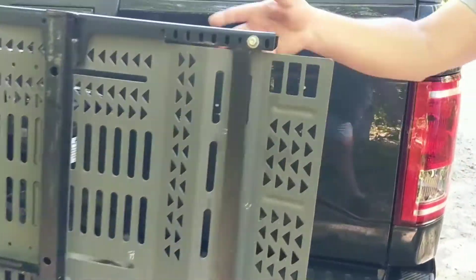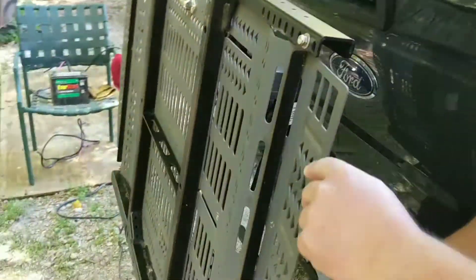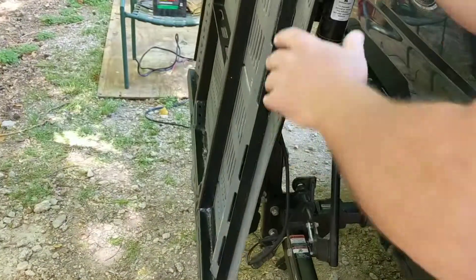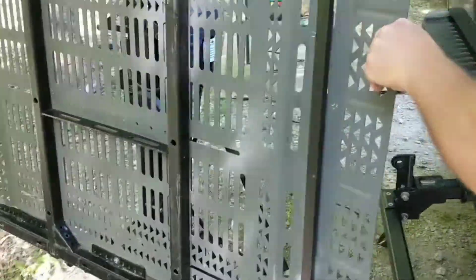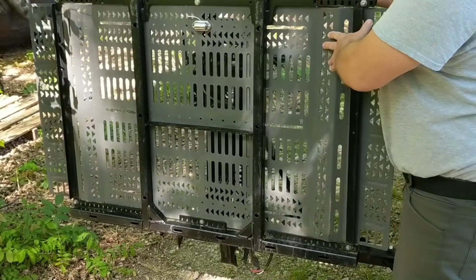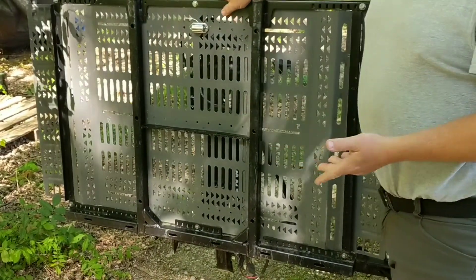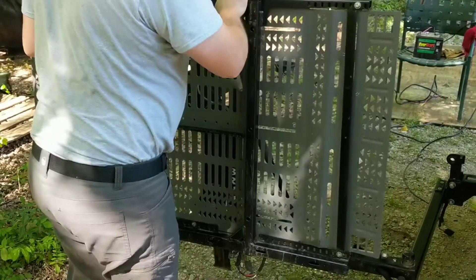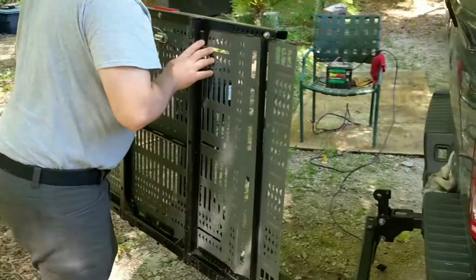There is also a swing-out feature. You see the handle here — just pull it towards you and it'll swing out. You can still raise and lower it from that position. You can find videos on this model on YouTube that will show you exactly how it operates.